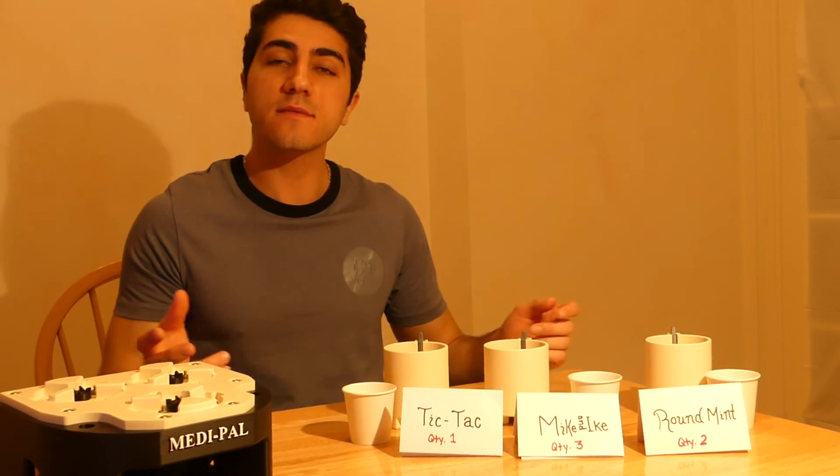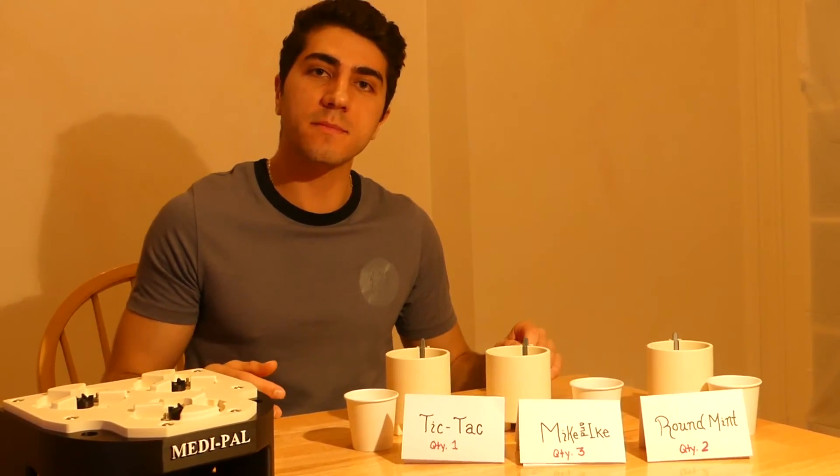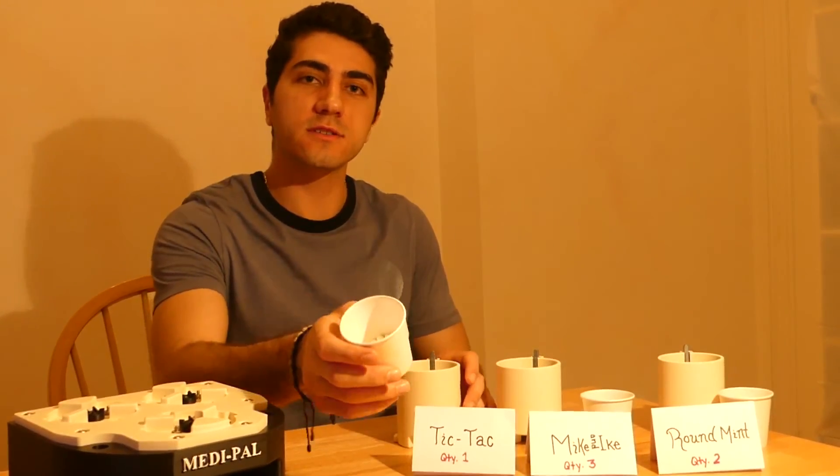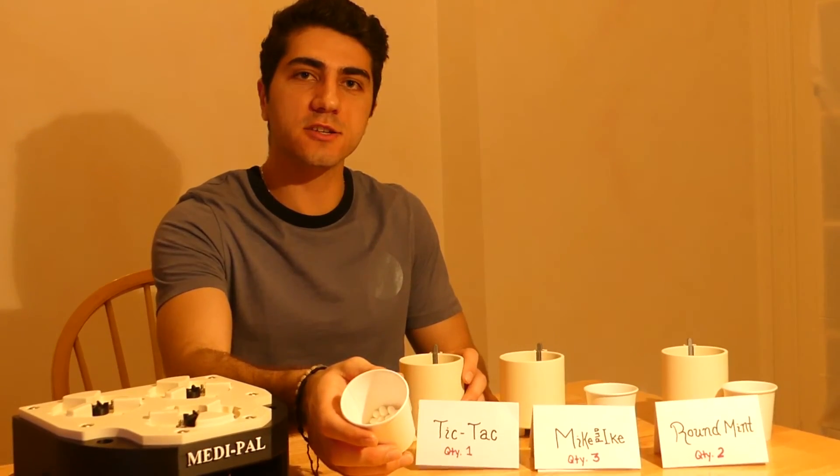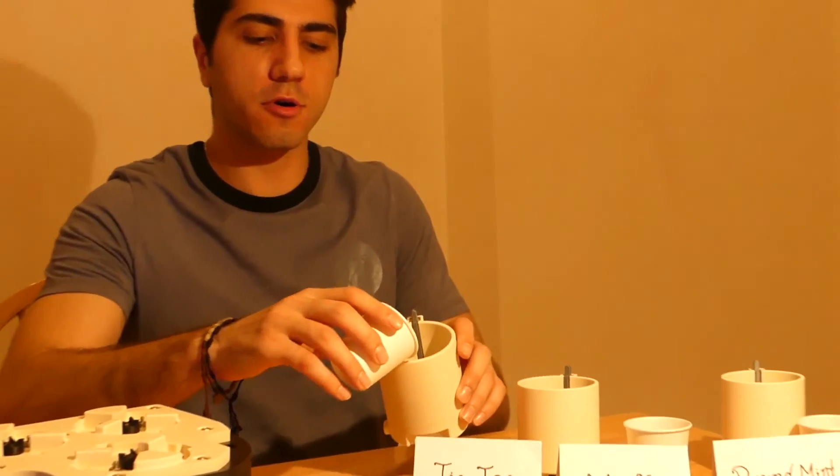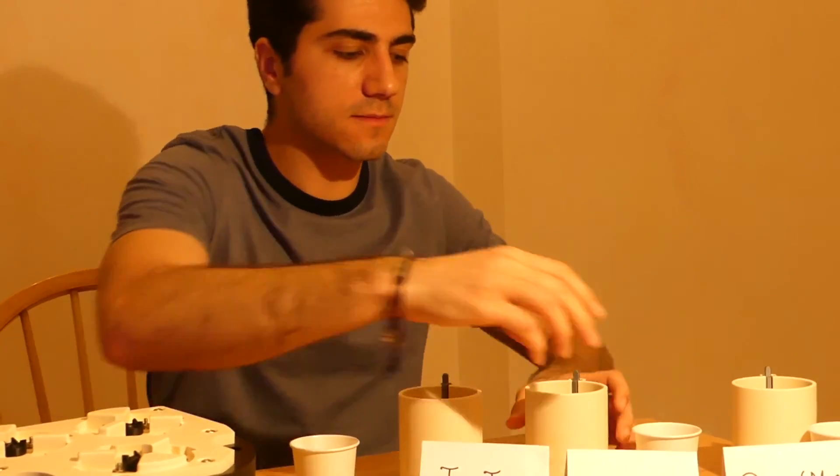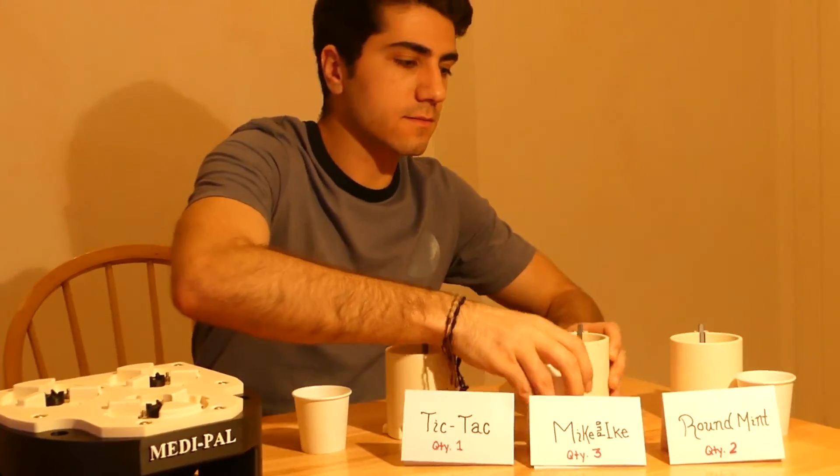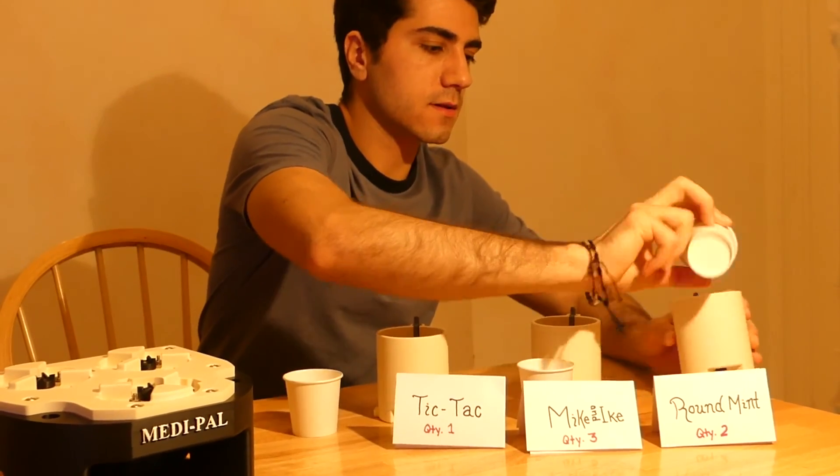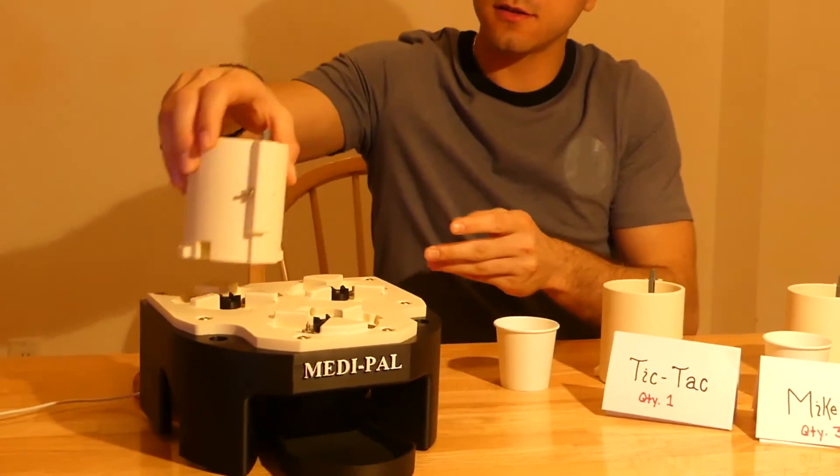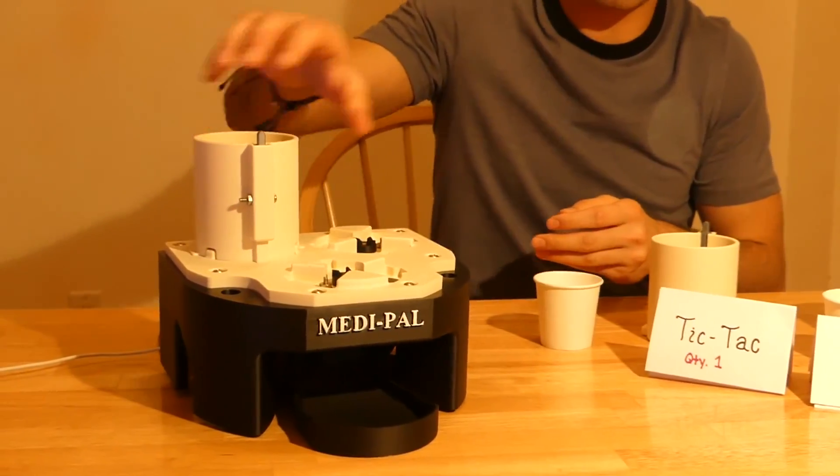Once everything is set up, the Medipel is very simple for the user to use. First, they take their medication, pour it into the correct cylinder, then load each cylinder onto the device.